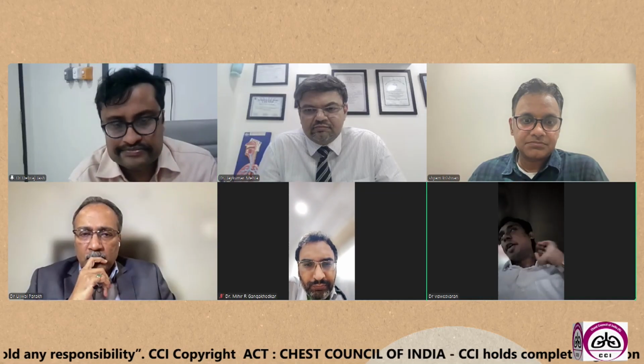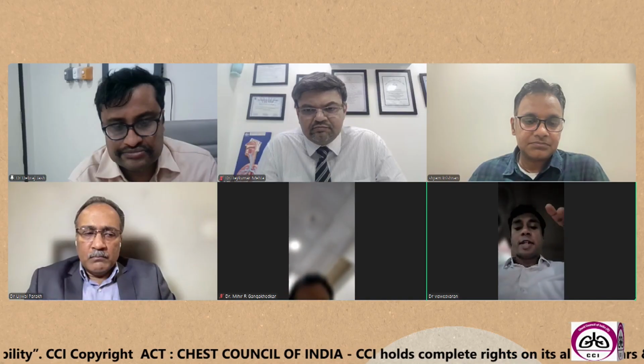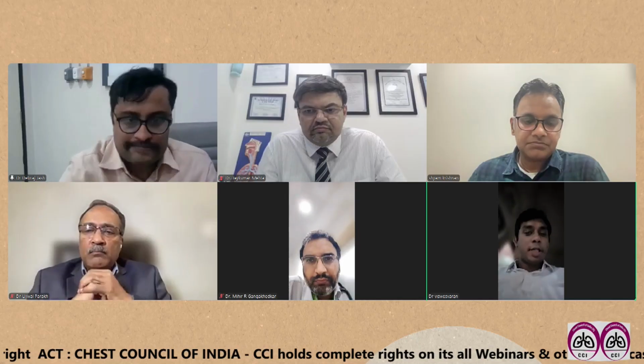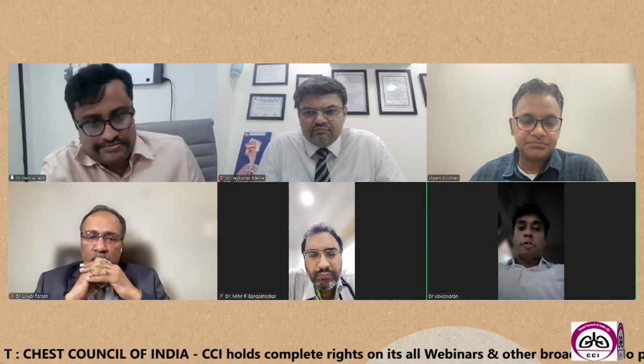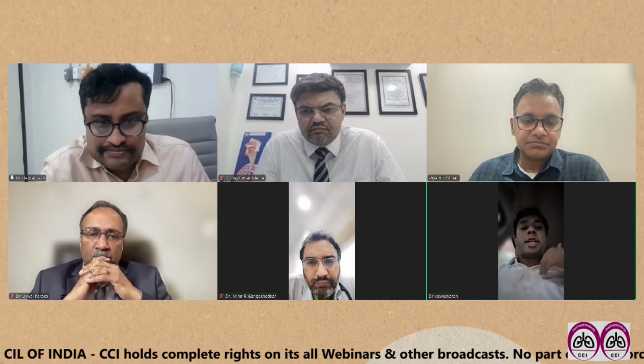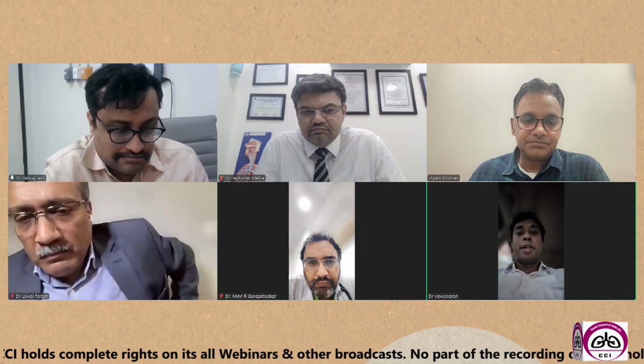So I will explain two things. One is with respect to the cyst. As you rightly said, it's better not to adventure into doing a cyst aspiration because it's not the cure for the patient. But as a novice, even we have tried. Like when we started, you all get excited seeing an EBUS cyst and you end up doing it.